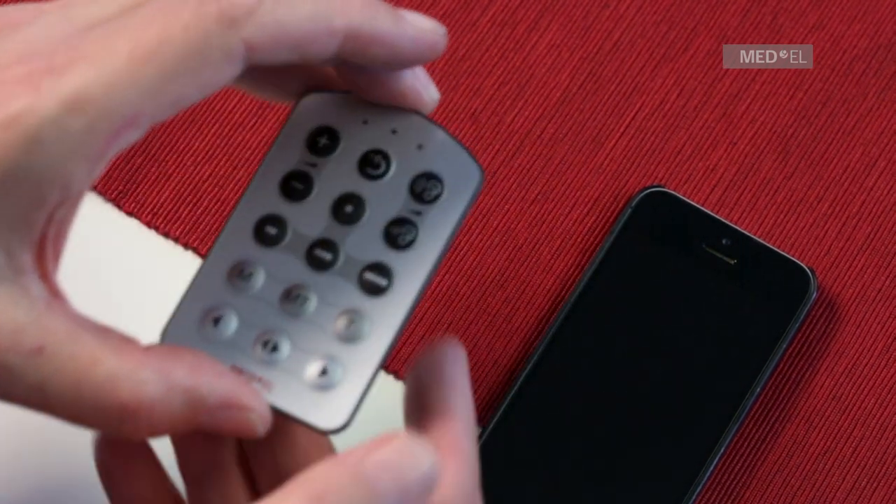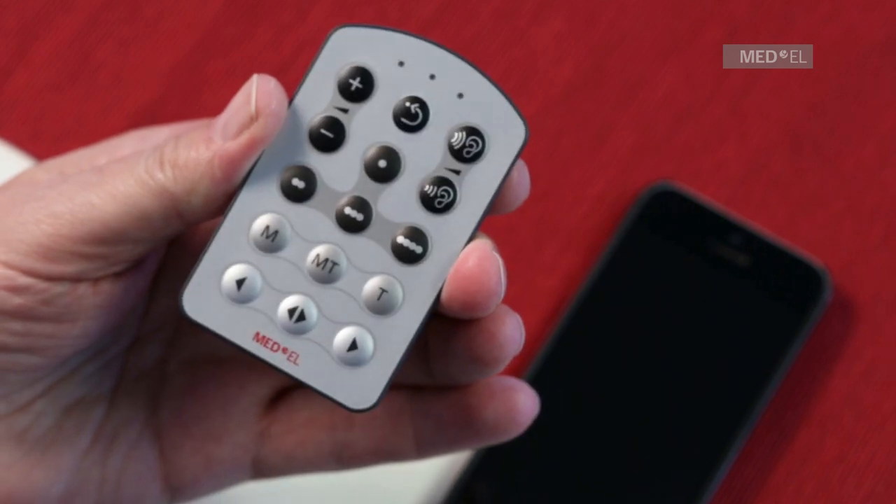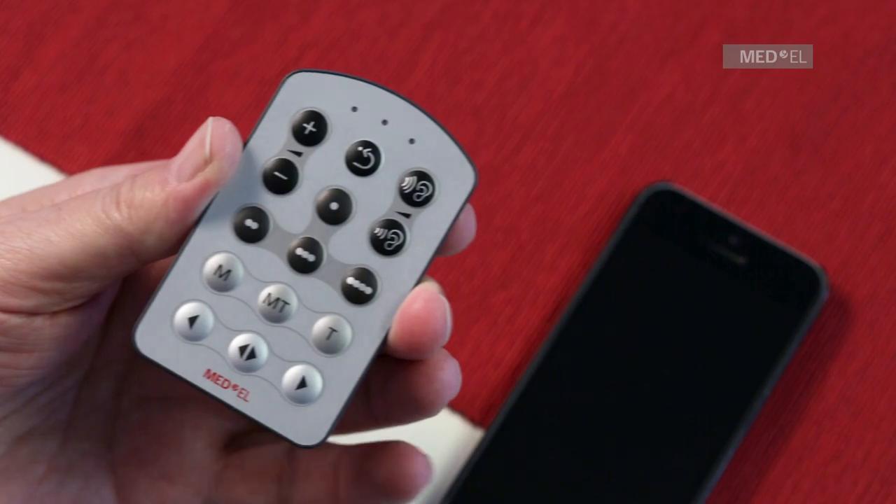Press the MT or T button on your fine tuner to start streaming. The T mode provides sound input only from your Bluetooth neck loop. The MT mode provides a balance of signal from the neck loop and the RONDO 2 microphone.